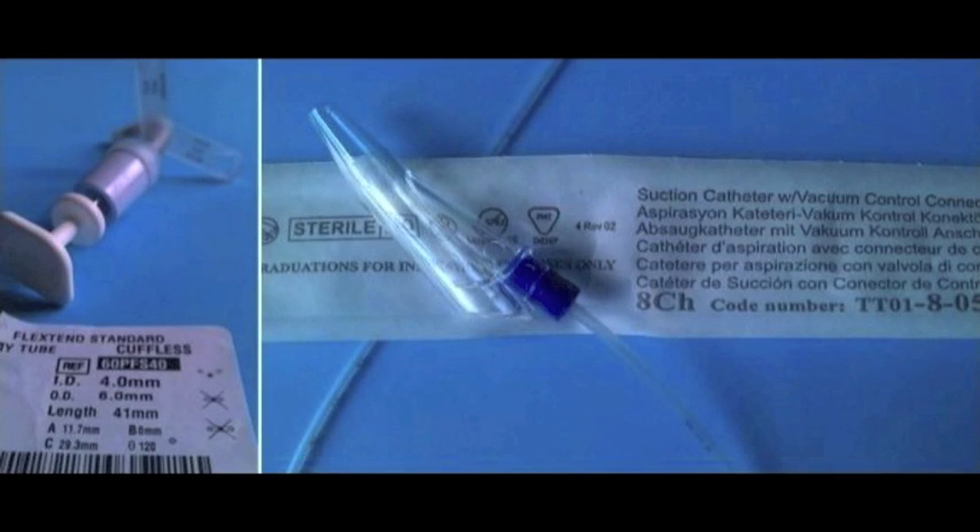The size of the suction catheter is worked out by multiplying the size of the tracheostomy tube by 2. For example, if your child has a size 4 tracheostomy tube, you should use a size 8 catheter.